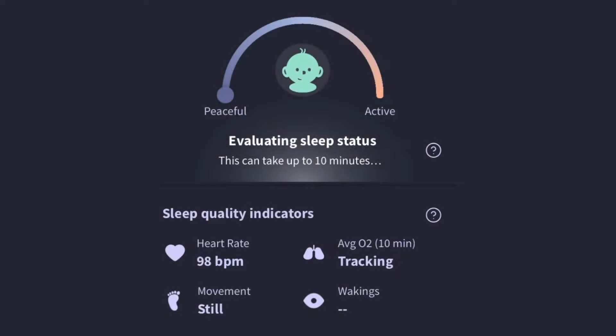Here's the real heart of the product: in the app, evaluating the sleep status is key. There are four things it picks up on as indicators — the heart rate, the average O2 over a 10-minute period, the movement, and the number of wakings.